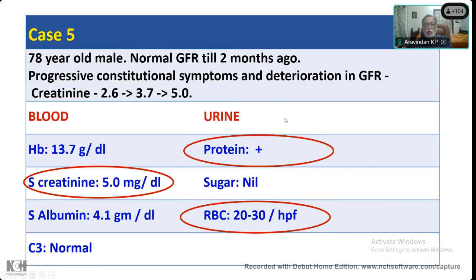So, what would you call it? What would be the clinical term you would use for a case in which there is a very sudden increase in creatinine? So it is some acute deterioration in GFR, affecting the tubules. Some acute injury affecting the tubular portion. Increasingly now, many renal biopsies that we get are for this kind of condition, where the patient suddenly comes with an acute kidney injury. We used to call it acute renal failure. Now nephrologists usually use the term AKI, acute kidney injury.